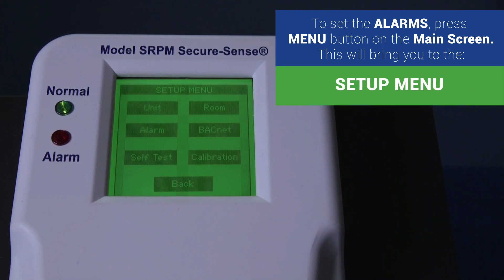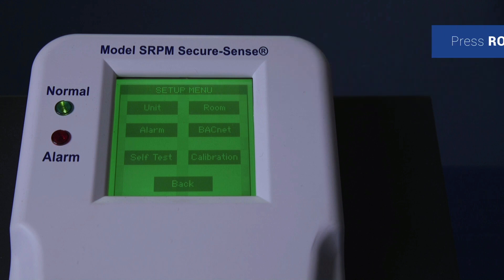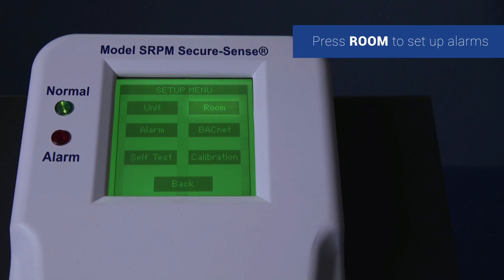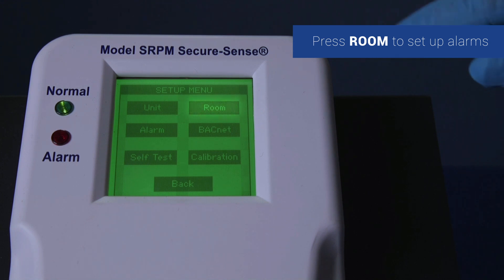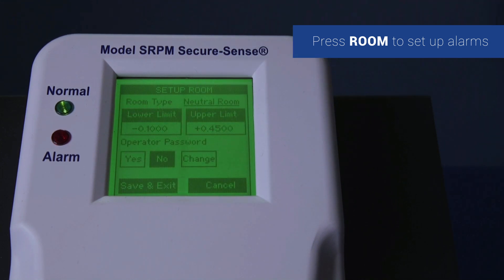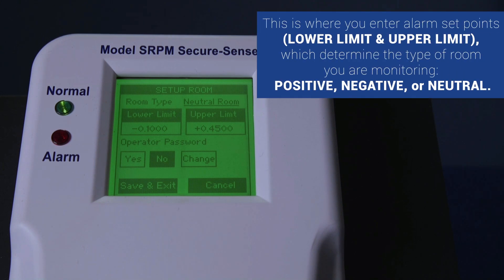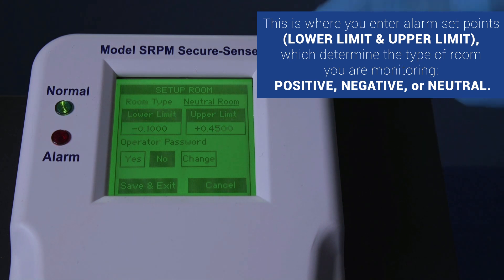This will bring you to the setup menu. Once at the setup menu, press room to get to the screen to set up alarms. This is where you enter your alarm set points, lower limit and upper limit, which determine what kind of room you are monitoring.